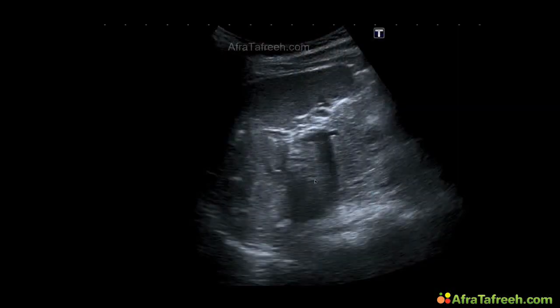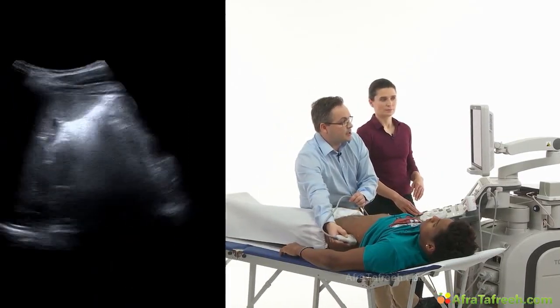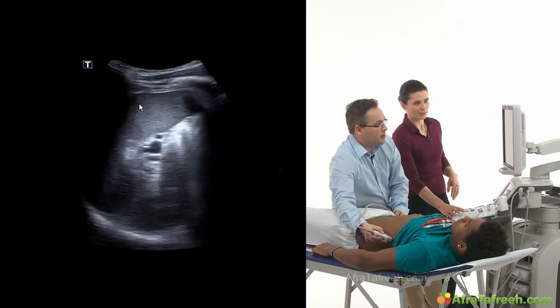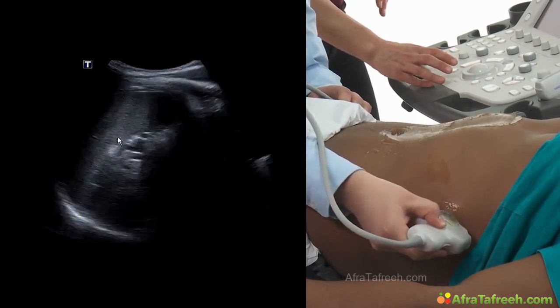In the sonographic finding, we see the spleen over here. There are the vessels of the spleen, which means the splenic vein is located here. And this tissue is pancreatic tissue. So, measured over here, the splenic vein and the tail of the pancreas. To get the full view on the tail of the pancreas, we have to change to a lateral view. So, nearly the same maneuver we use to find the spleen. I can see already the spleen over here. So I place the probe in between the ribs, in the intercostal space over here. Try to find the splenic vein again.